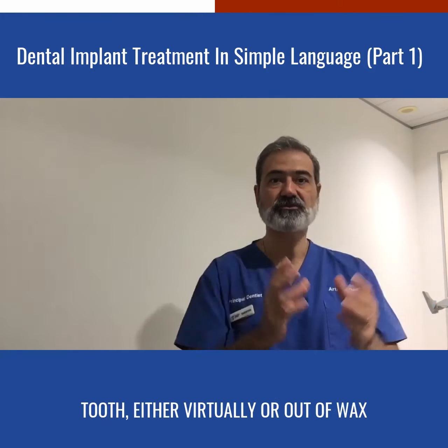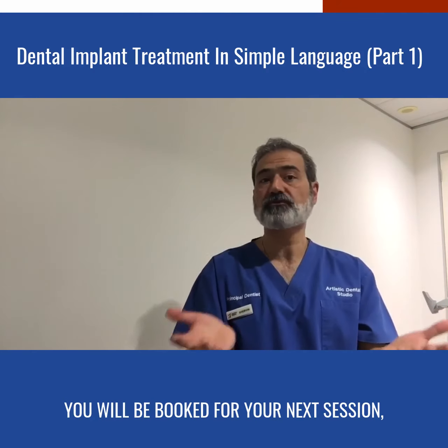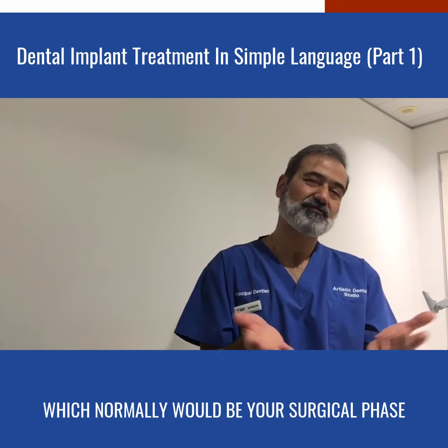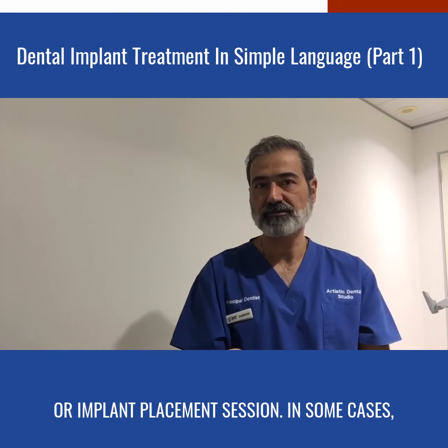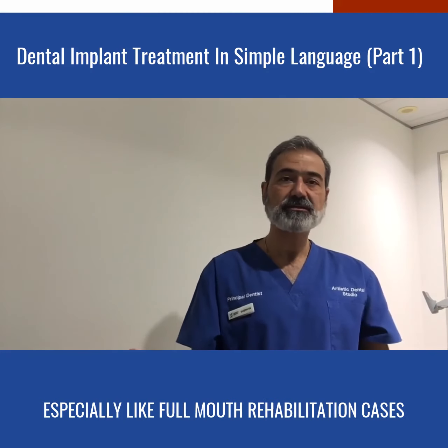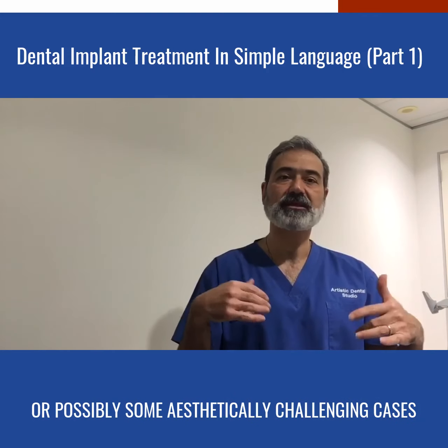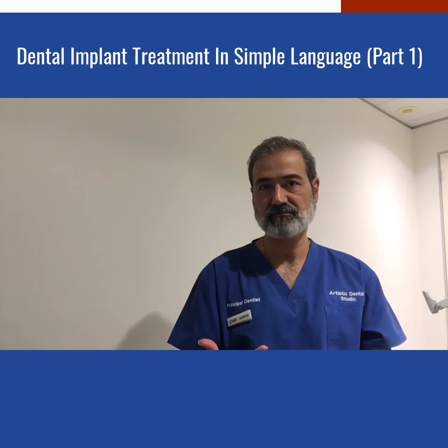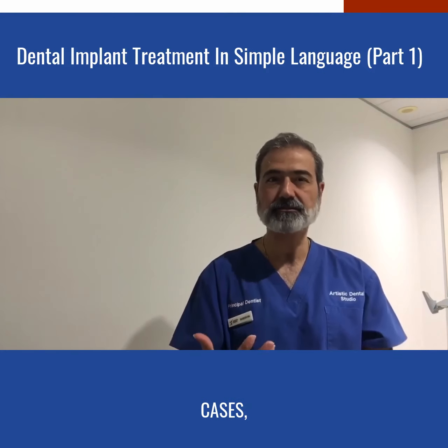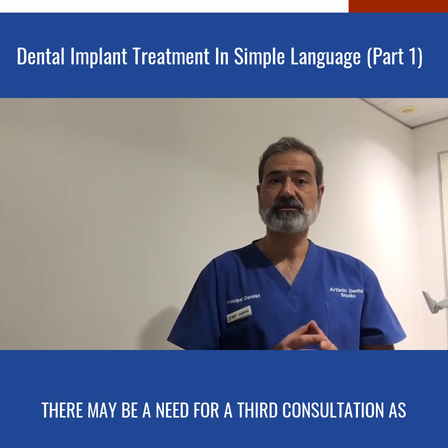Normally, on this second consultation, you and your dentist could come to an agreement on what needs to be done, and you will be booked for your next session, which normally will be your surgical phase or implant placement session. In some cases, especially like full mouth rehabilitation cases, or possibly some aesthetically challenging cases, some more complicated cases, there may be a need for a third consultation as well.